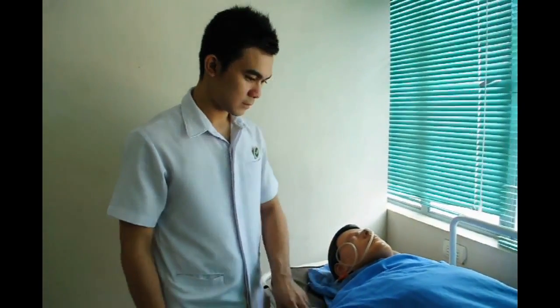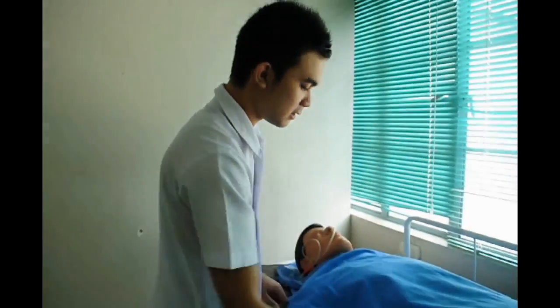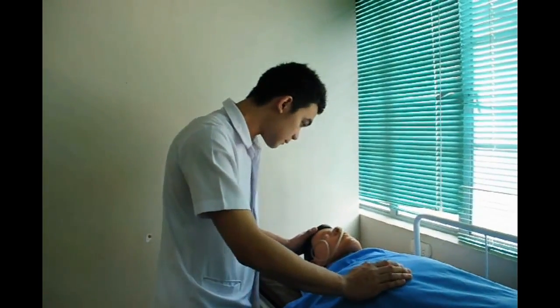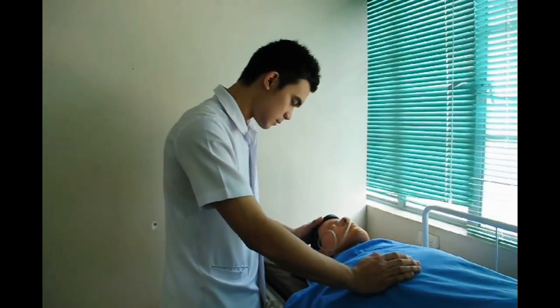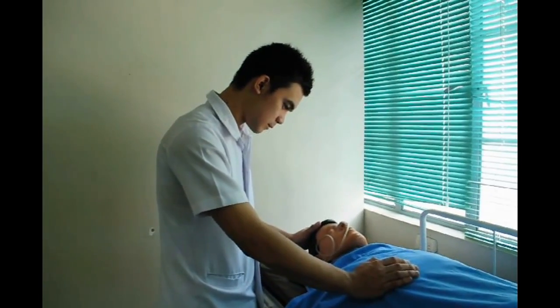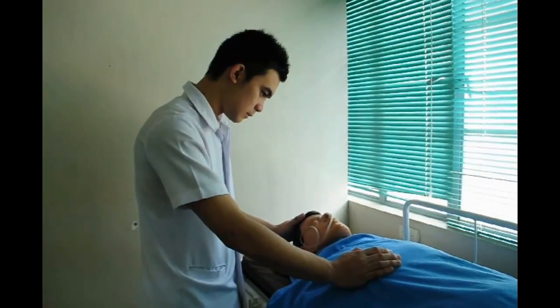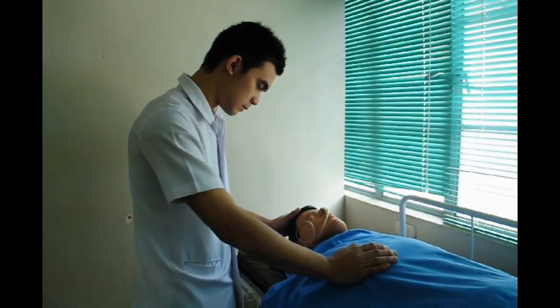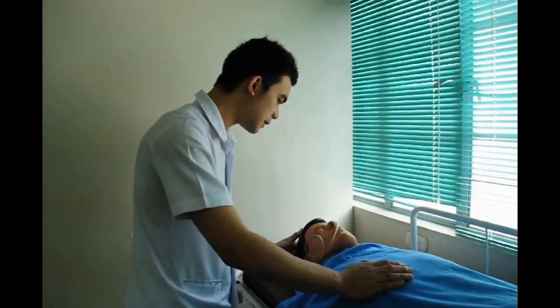Good afternoon, ma'am. Good afternoon, nurse. Nurse Kelvin is going to identify the patient. This is to ensure that the patient who is going to receive the feeding is the right patient. Good. Patient Colata. Now, Nurse Kelvin will explain the procedure and why this intervention is needed for conscious patients. This is to let the patient know about the procedure and alleviate his or her anxiety. But when the patient is unconscious, he is going to proceed to the next procedure. Sir, I'm going to feed you now, okay?